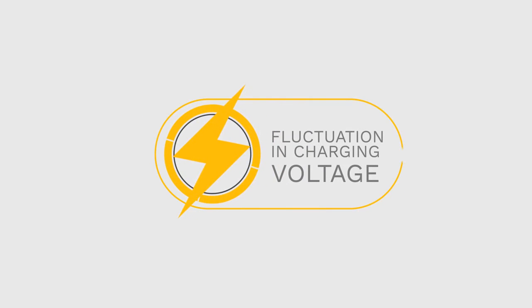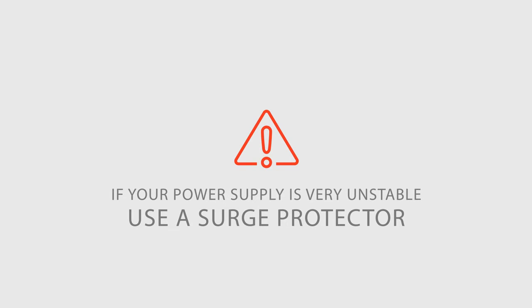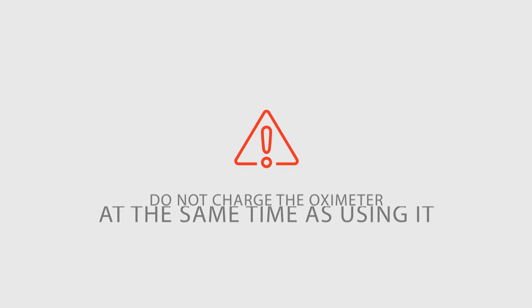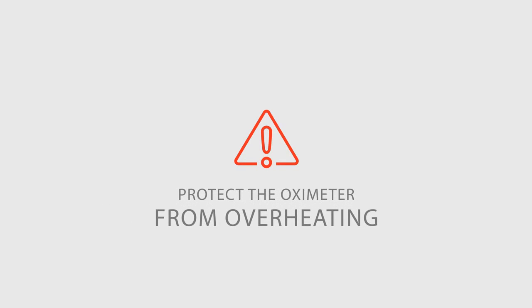The oximeter can handle some fluctuation in charging voltage, but current surges may damage the machine over time. If your power supply is very unstable, use a surge protector if possible and do not charge the oximeter at the same time as using it. In this way, you will protect the oximeter from overheating.